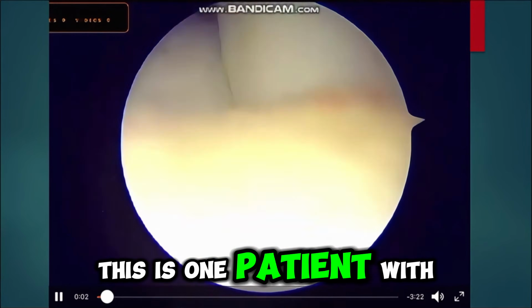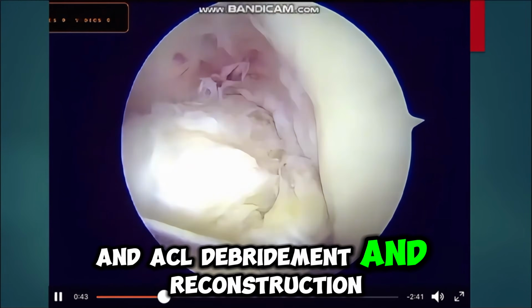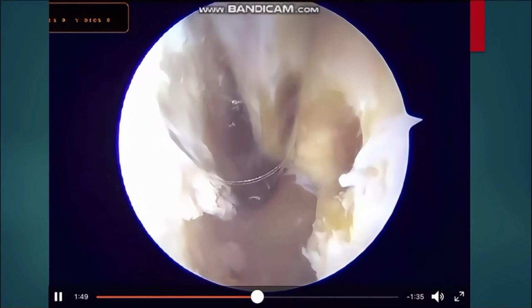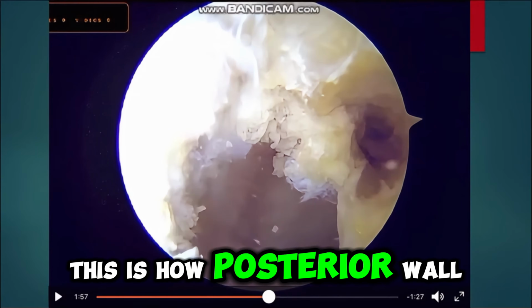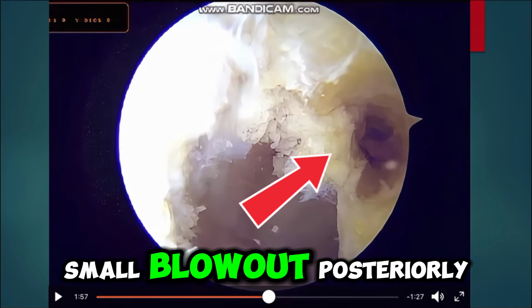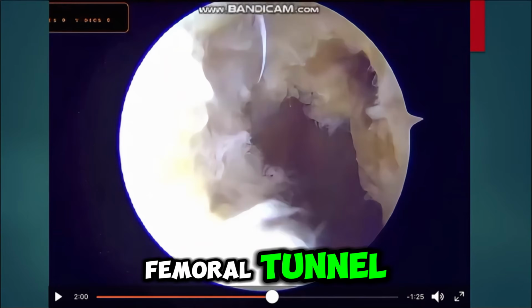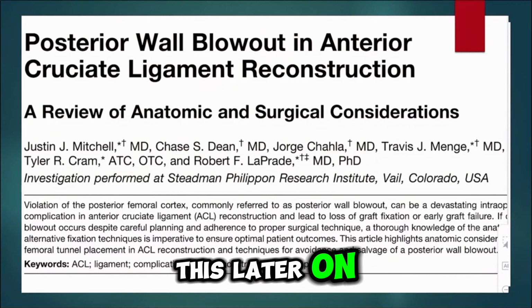This is one patient with mucoid ACL, and ACL debridement and reconstruction was done. As you can see here, after ACL debridement, this is how the posterior wall is made, and you can see the small blowout posteriorly of the femoral tunnel. I would like you to remember this image, and we will come to this later on.